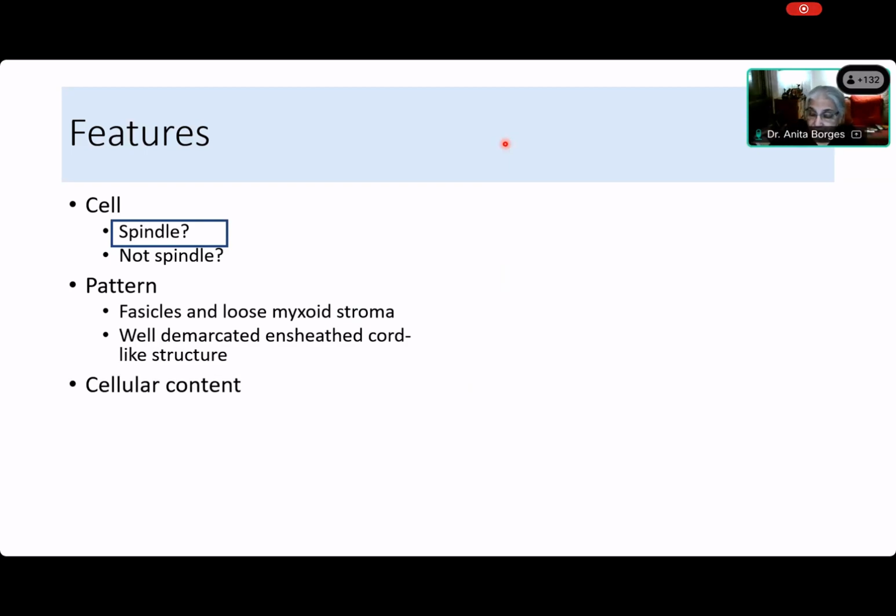All right. So what is the cellular content now? Chiefly composed of spindle cells, ma'am, and collagen. But it is characteristic, and I want you all to notice this. It is the characteristic thin, wavy nuclei, wavy cytoplasm, and shredded carrot collagen. Okay, which is so typical.